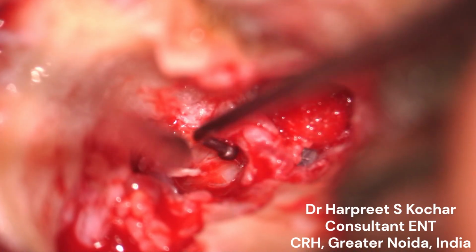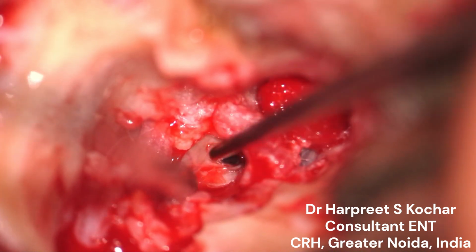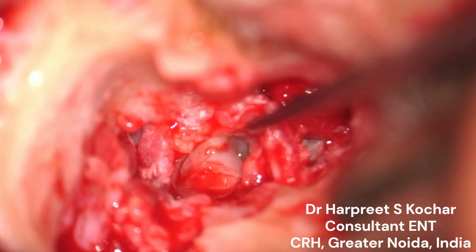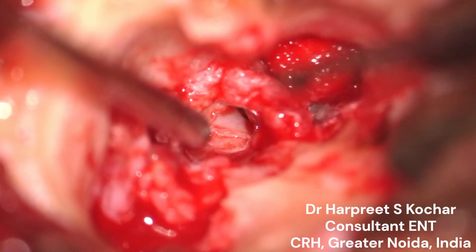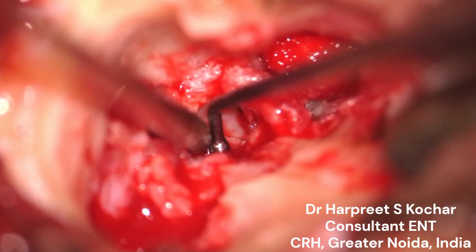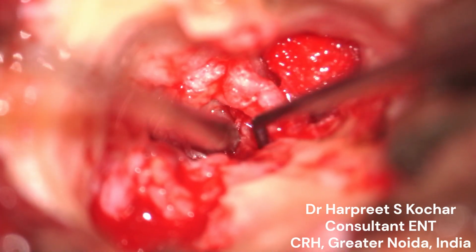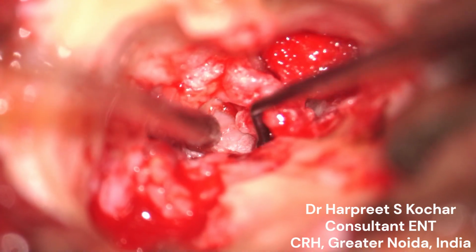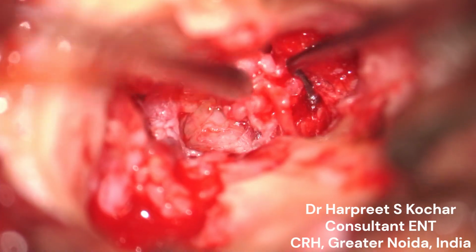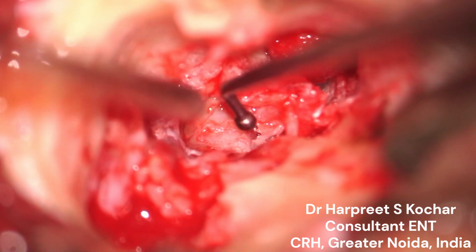Here you can see the epithelium is being lifted off with blunt dissection from the dehiscent facial nerve. Blunt instrumentation is required in this area, so as to avoid any damage, and suctioning is being done continuously to look at the interface between the epithelium and the normal structures so as to keep the dissection in the correct plane.